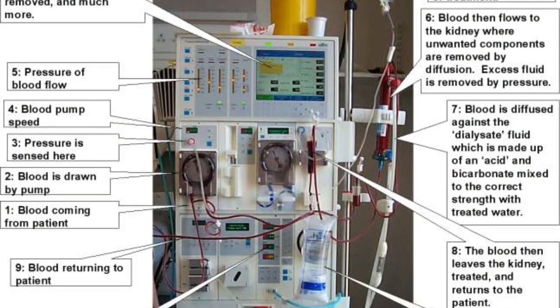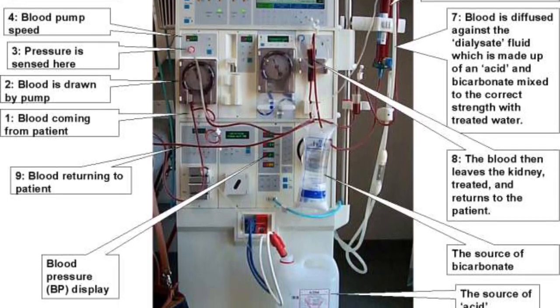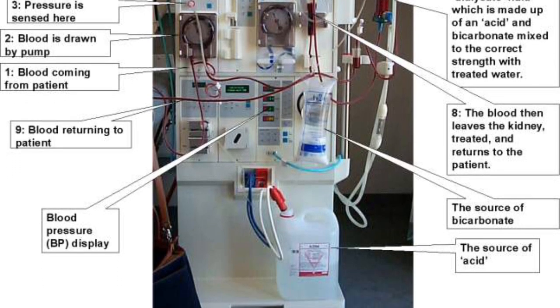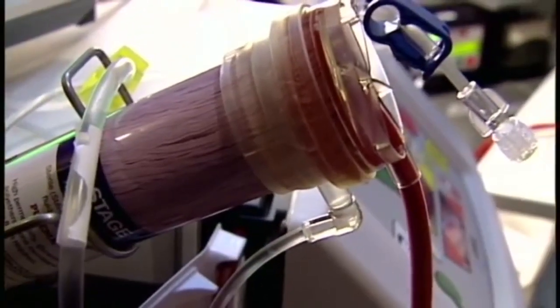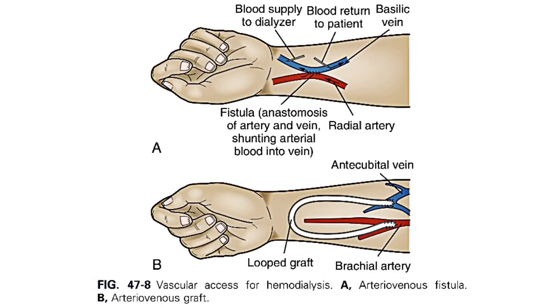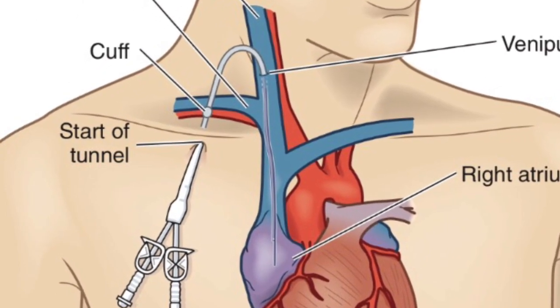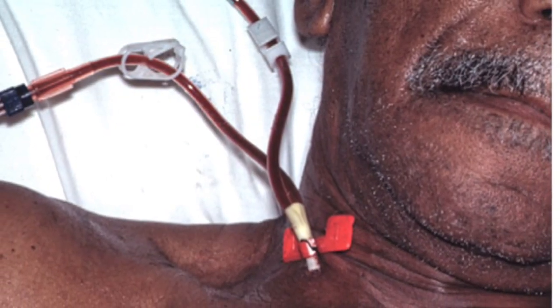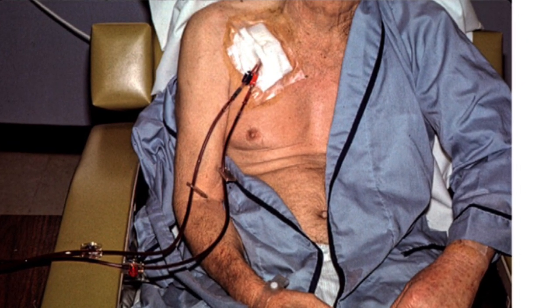Heparin is also added to the blood as it travels through the dialyzer to prevent any clotting that may occur due to the blood making contact with foreign substances. A dialysate delivery and monitoring system is used to pump the fluid through the dialysis machine, countercurrent to the flow of the blood. The procedure is finished by flushing the system with a saline solution to return blood in the extracorporeal circuit back to the client via the vascular access. Once the needles have been removed from the access lines, firm pressure is then applied. Pressure is held in place until the bleeding stops.